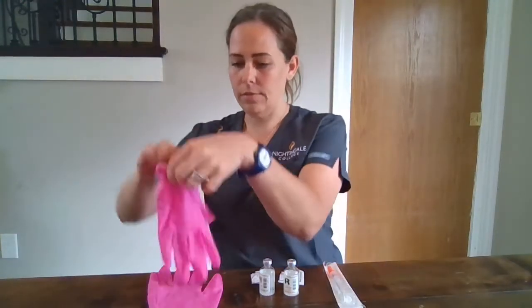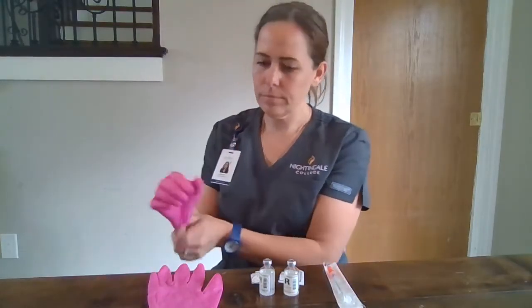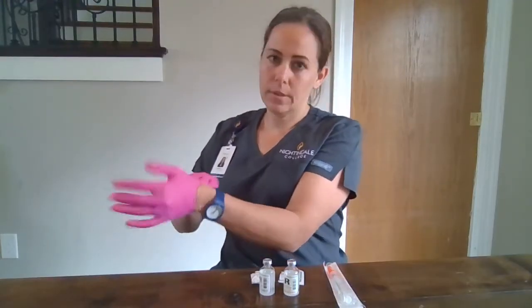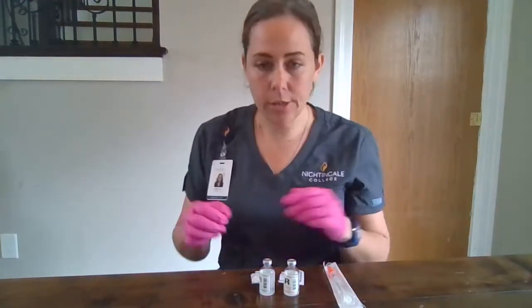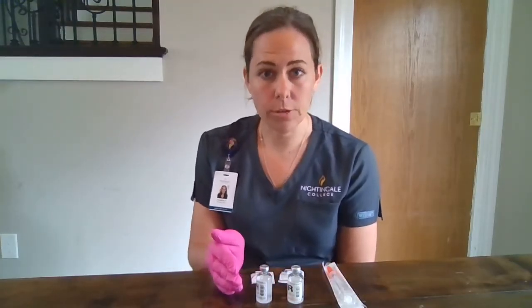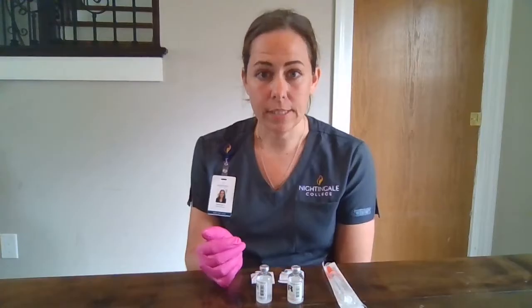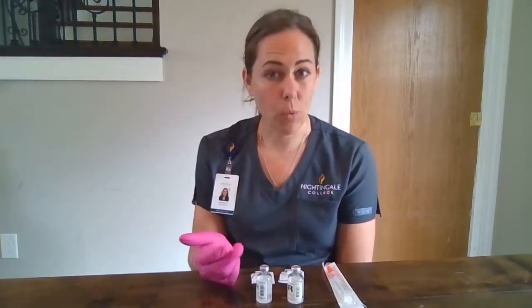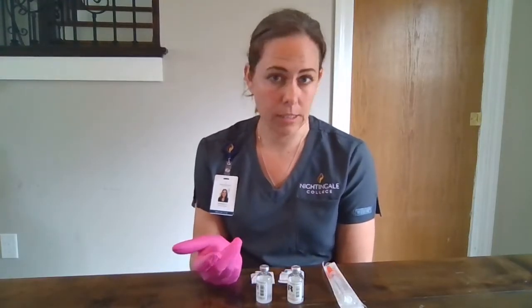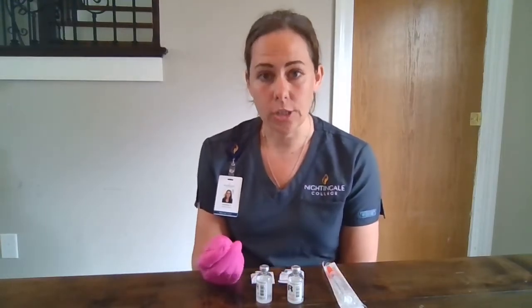Do our hand hygiene and our gloves. All right, Mr. Smith, today your doctor has ordered some regular insulin and an intermediate-acting insulin. Insulin is a hormone that we use to help regulate blood glucose levels in diabetic patients. It helps your body move the glucose from your blood into the cells so they can use it for energy. Some of the side effects are injection site pain, weight gain, and rash. More concerning side effects would be headache, dizziness, blurred vision, and palpitations — let me know right away.